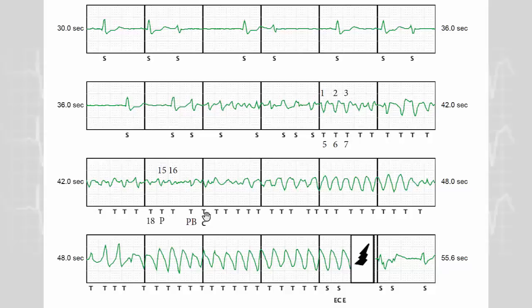Before the onset of the charge, you also need to fulfill a second criterion, which is the charge confirmation algorithm. The device will count the number of T, and you see 1, 2, 3, 4, 5, 6, 7, 8, 9, 10, 11, 12, 13, 14, 15, 16.